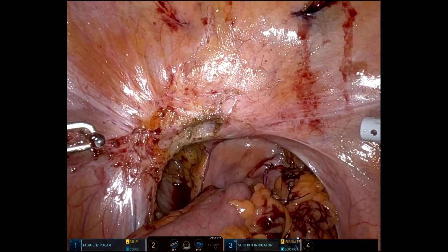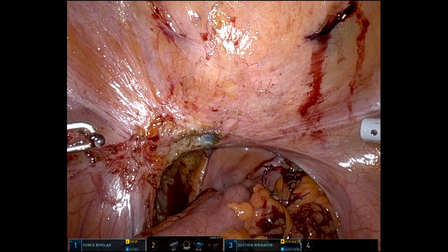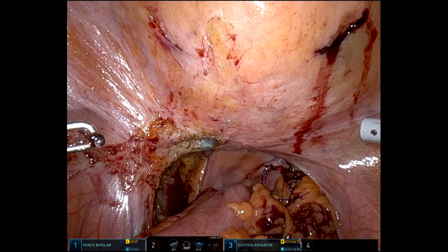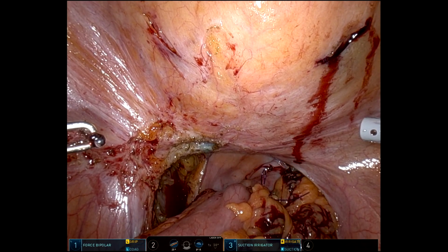And now we'll test the bladder and ensure that the hole does or doesn't need to be repaired. You saw a little flash of methylene blue right there. You saw the ICG leaking from before. I'm still doing this as a formality.